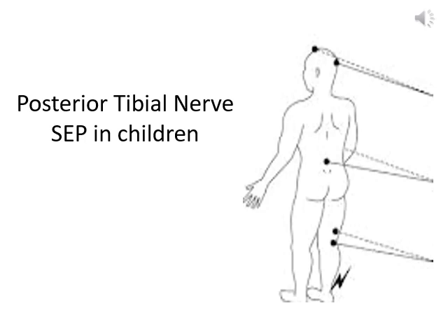What's different is that the middle 3 tracings in our recordings are different montages using the lumbar spine electrodes. And so they may be L1 reference to iliac crest, L5 reference to iliac crest, or L1 reference to L5. And using these different montages allows us to better see and identify the lumbar response.